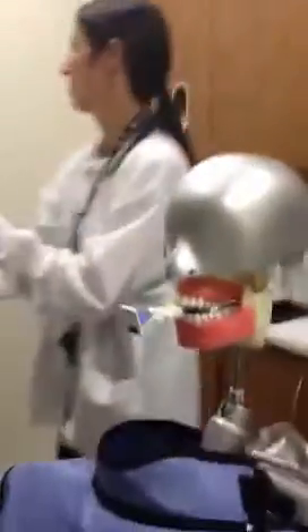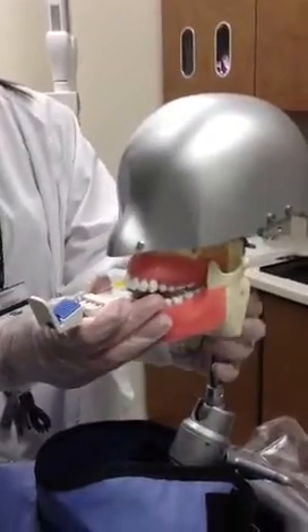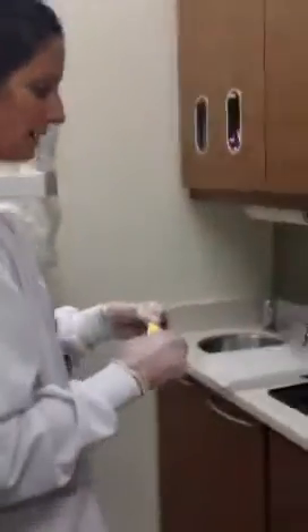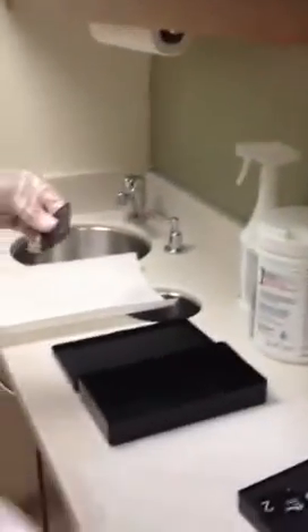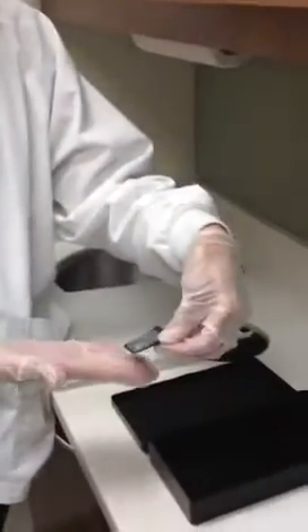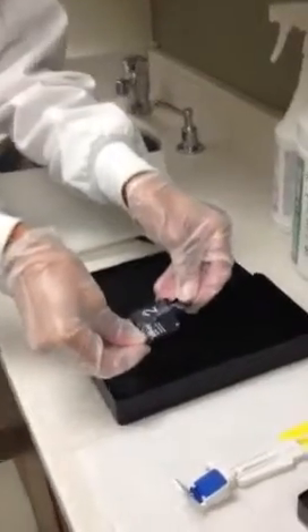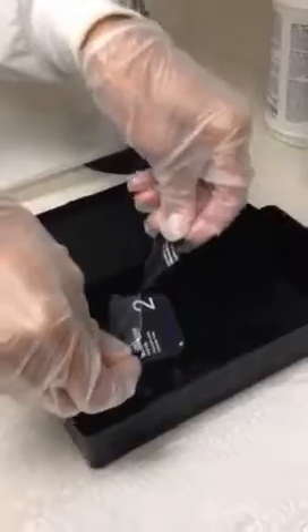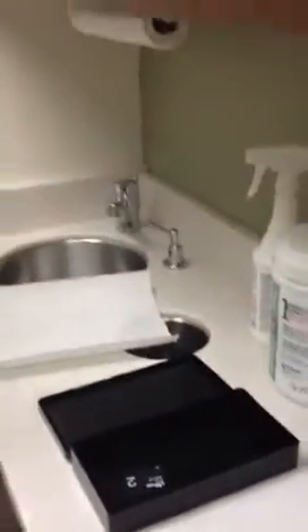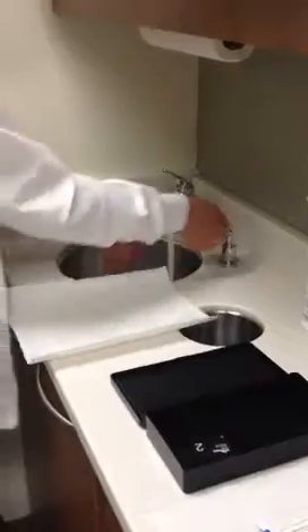You would expose all of your phosphor plate sensors. Once you've exposed all of them, with your gloved hands — without touching the transfer box — you want to peel open the barrier with the words facing you. The part of the film that has captured the image will then be against the black part of the box. I would then remove my gloves and wash my hands.